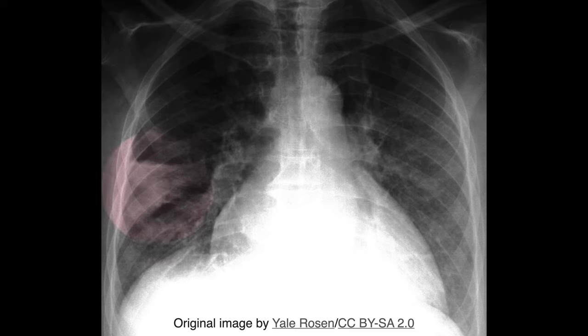The wedge-shaped opacity in the periphery of the lung is a rare but suggestive finding of pulmonary infarction. The base is juxtaposed to the pleural surface, while the rounded apex — that is, the hump — is angled towards the hilum.